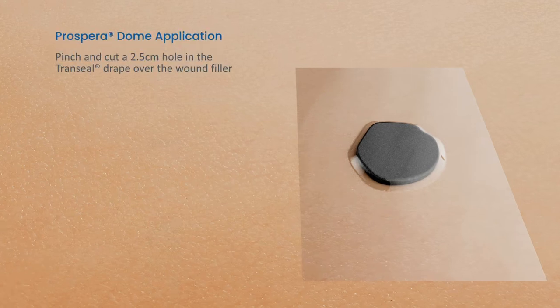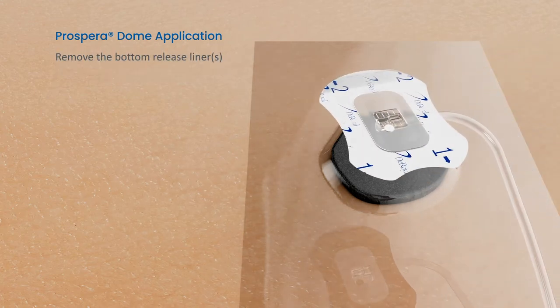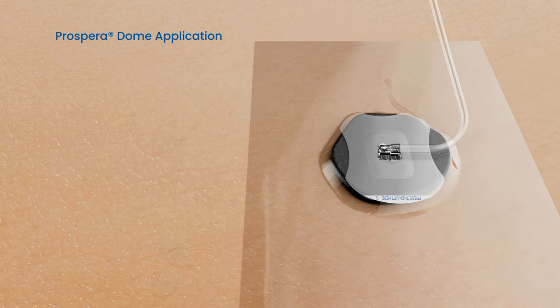Pinch and cut a 2.5 cm hole in the trans-sealed drape over the wound filler. Next, take the dome and remove the bottom release liners 1 and 2. Place the center of the dome pad directly over the hole. Position the direction of the tubing to optimize patient comfort and dressing securement.